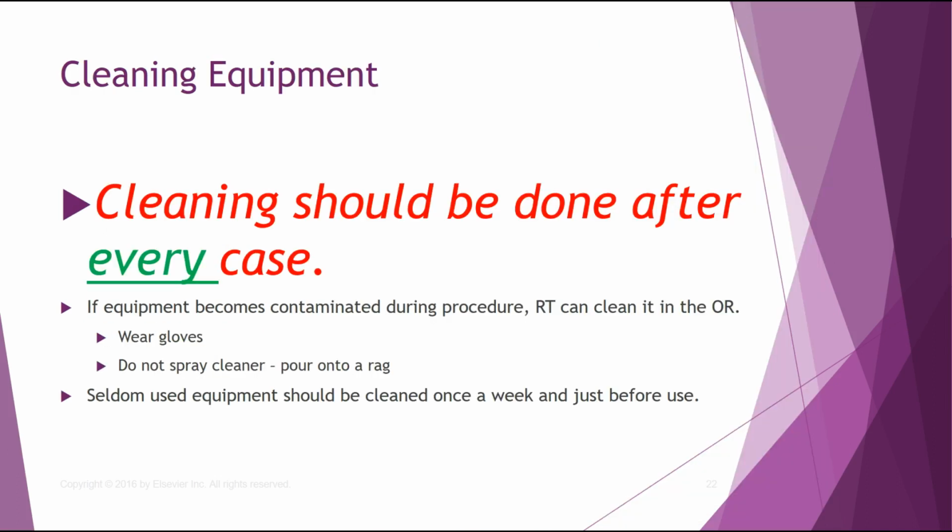Okay, you should always, always clean your equipment. And this doesn't happen all the time like it should, so you need to really make an effort and be conscientious about keeping your equipment clean. It's best for the patients.